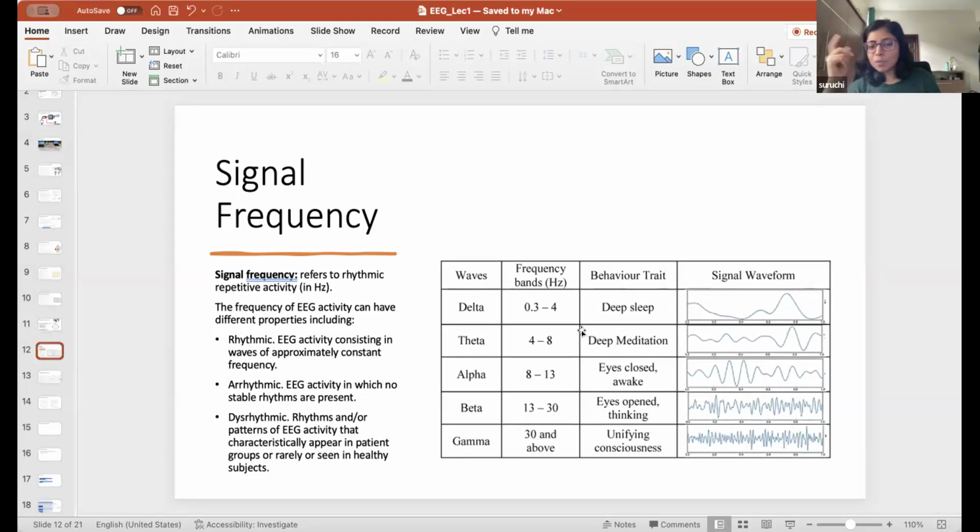Depending on how many, all these delta, theta, alpha, beta, gamma are very important for a biological brain. Most species will show all of these frequencies. It's something that is natural to our brains. That is why these frequencies are important. If you take a human and you are seeing something at 200 beats per second, you will say it's not human, right? It's an alien, or something is wrong with the machine. So these are very important biological frequencies.